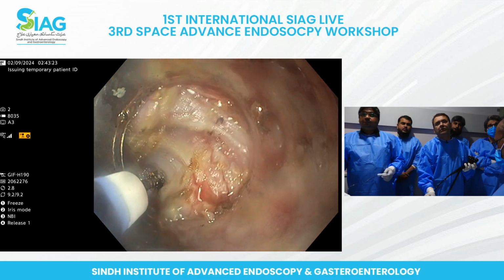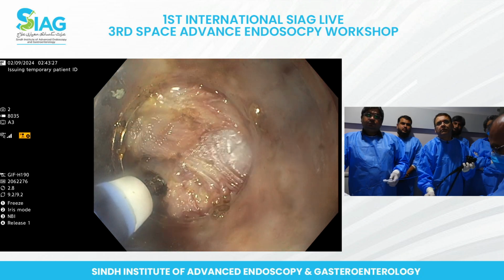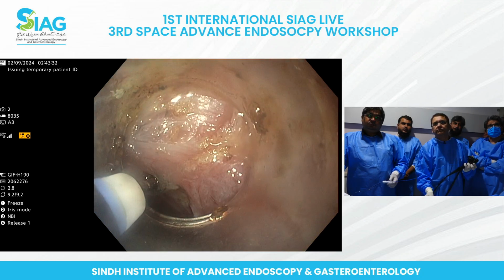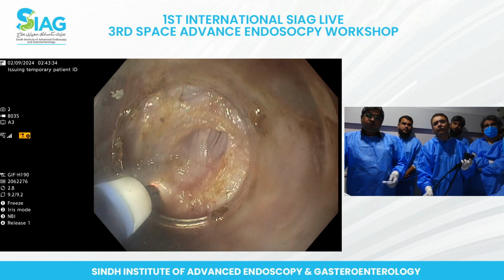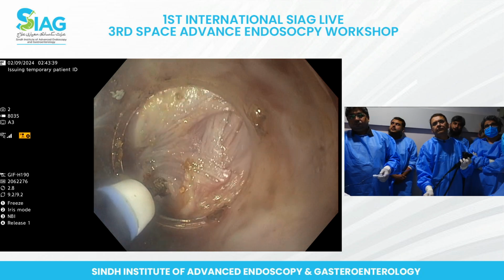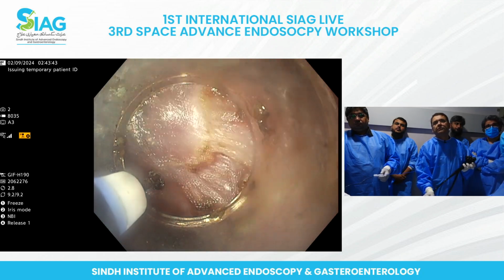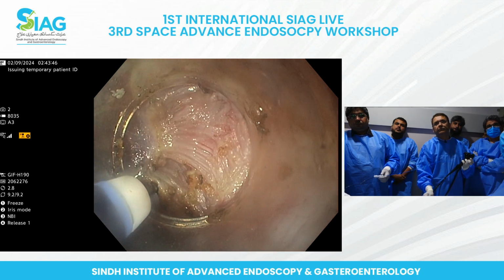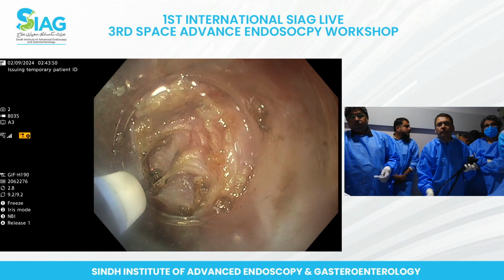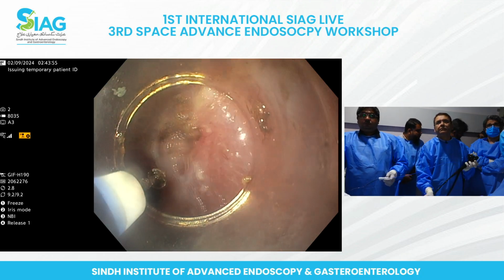Khalid, we're seeing this done very masterly. Ready, we'll go there. This is almost done.